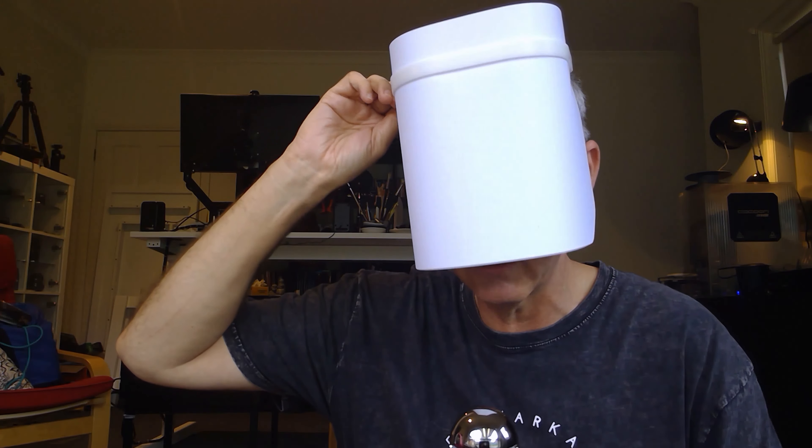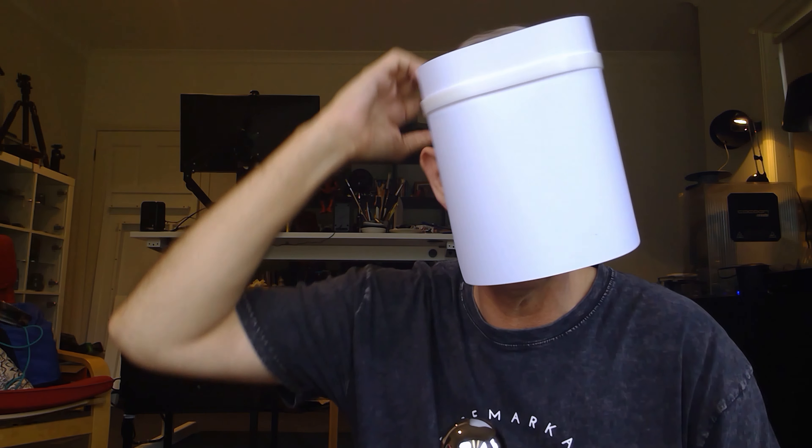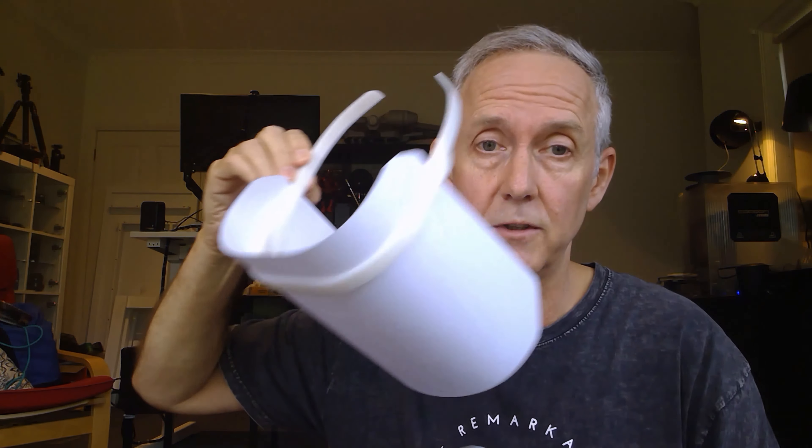I just cut the corners off to take away any sharp edges. But once it's on, it offers a fair bit of protection to the face. I'm doing this one-handed because I've got my microphone in the other hand.